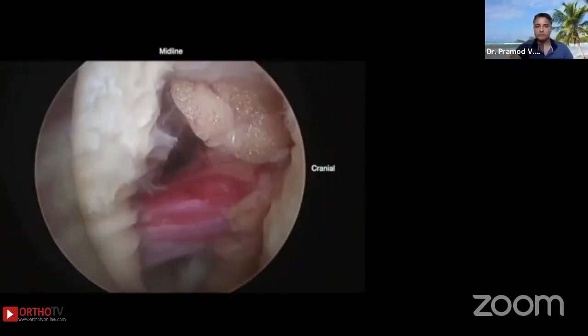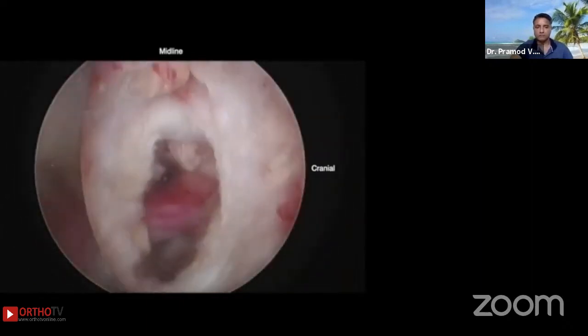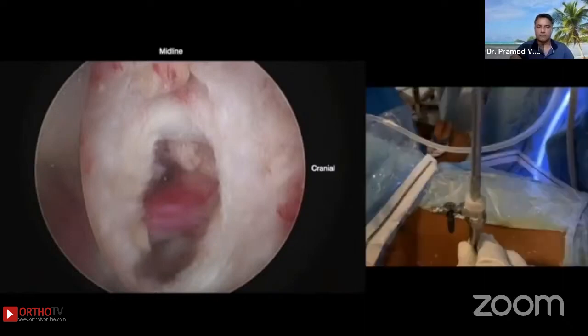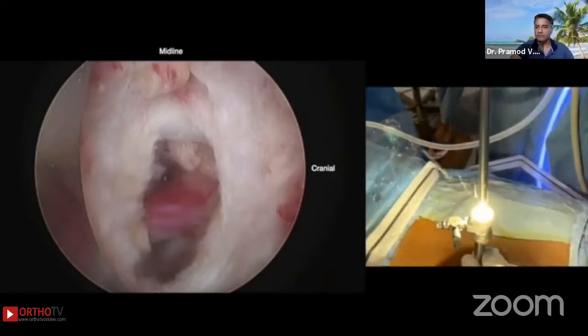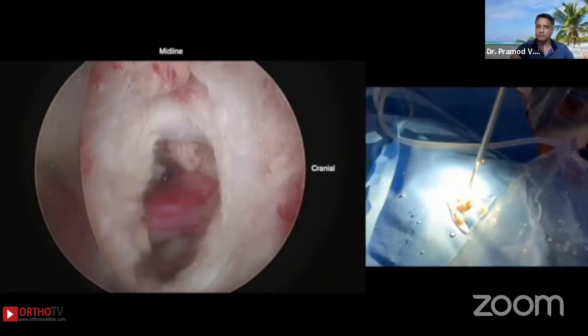The 25 degree angled endoscope allows us to look under the dura and the nerve root also. And you can see that the entire surgery has been done through a small slit 2.5 millimeters wide and 1 centimeter long. So this is a clinical video showing the removal of the large herniated mass through the endoscope.